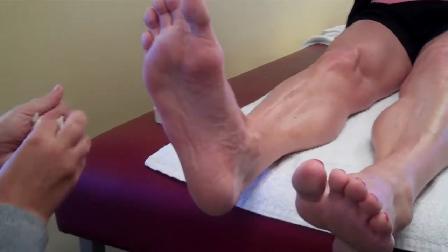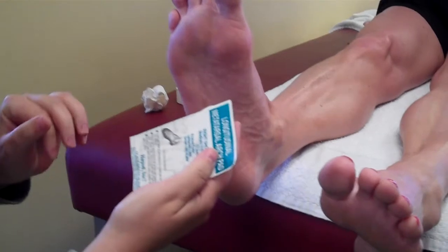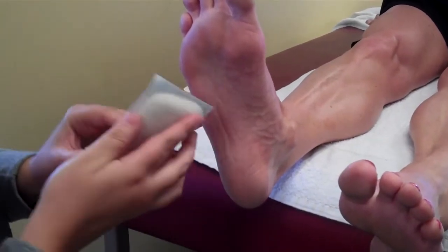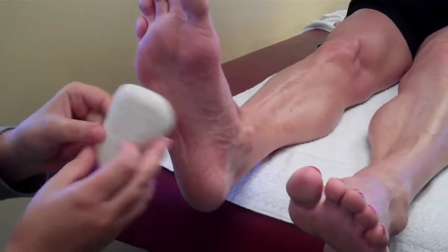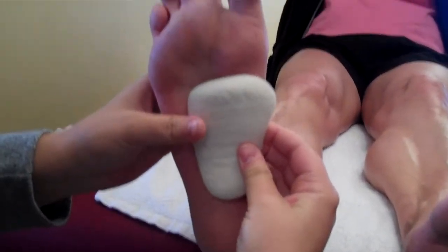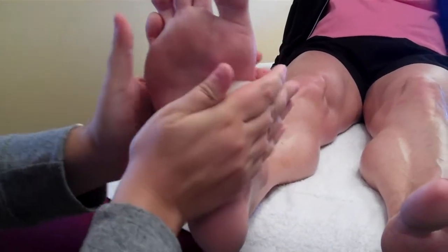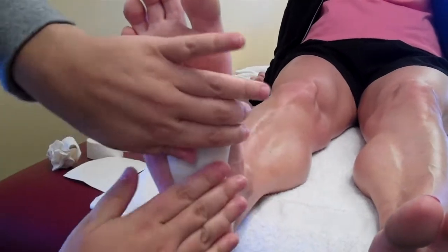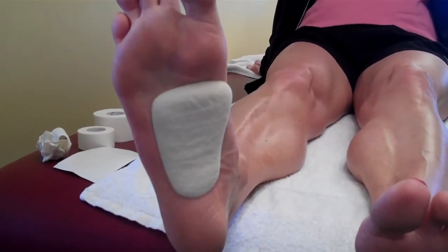Another modification you can do is using a MET pad. They come in different sizes — this one is medium. You want to take the edge of this pad here, and kind of go along the line of the foot, and just stick it on the skin, making sure it really sticks on. Then you would do the low dye technique over that. That's the second modification.